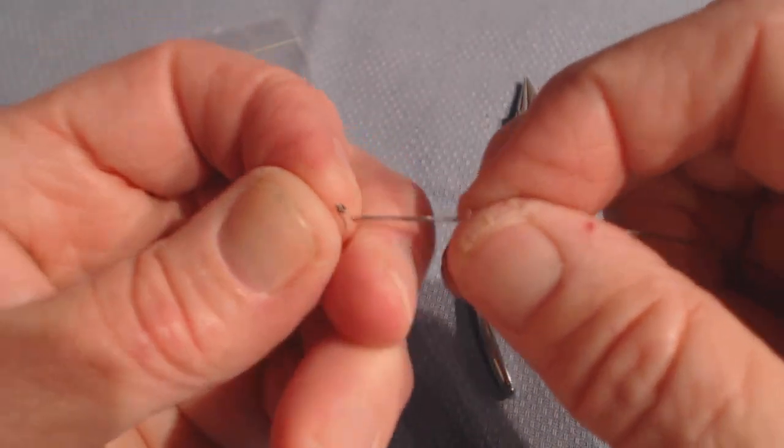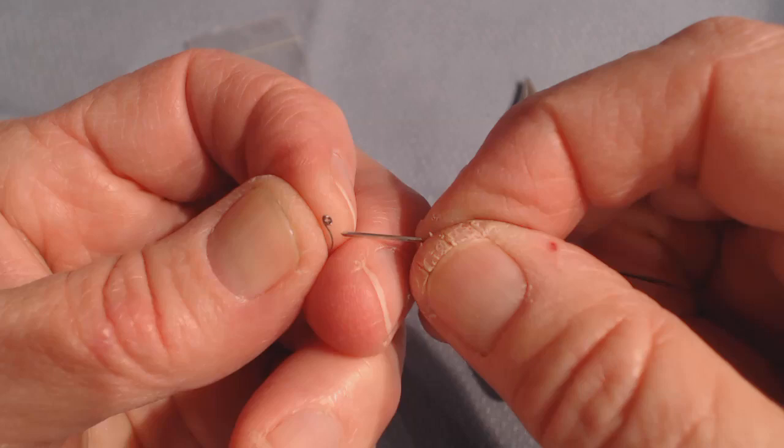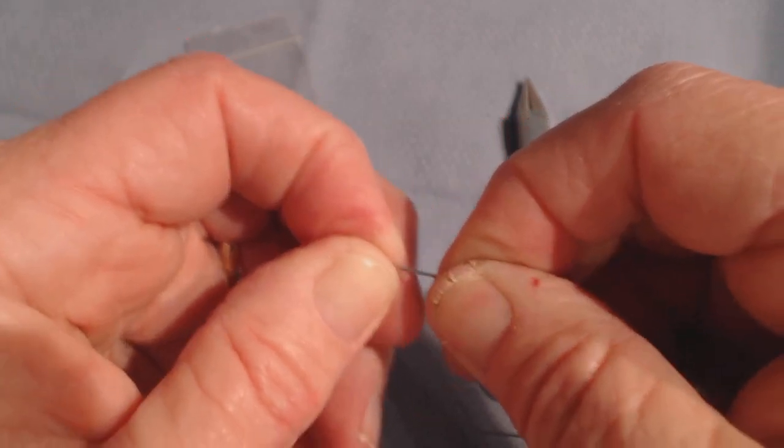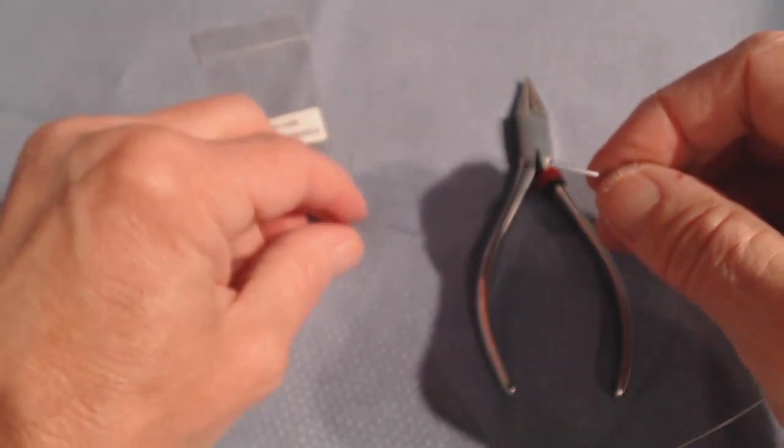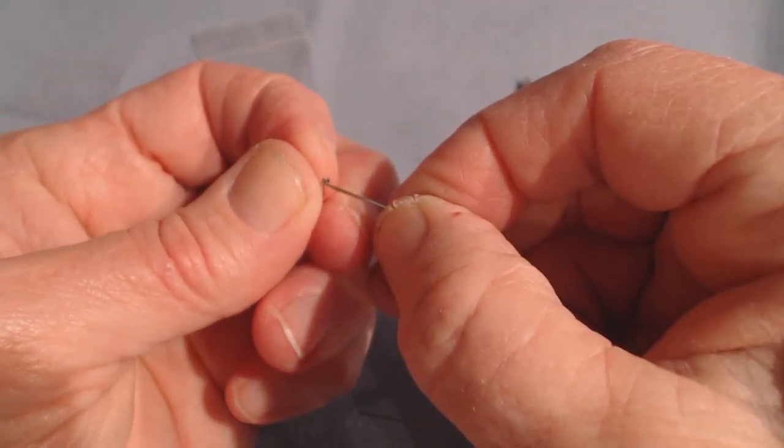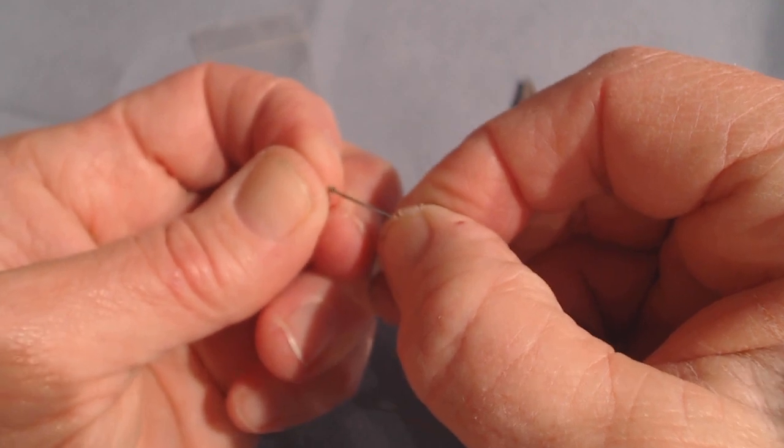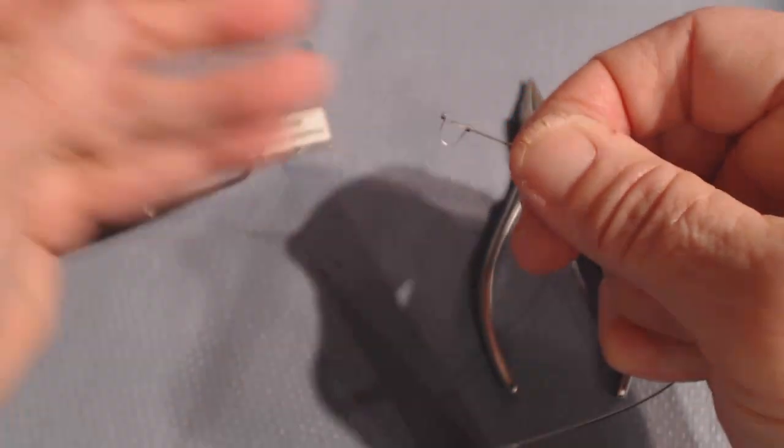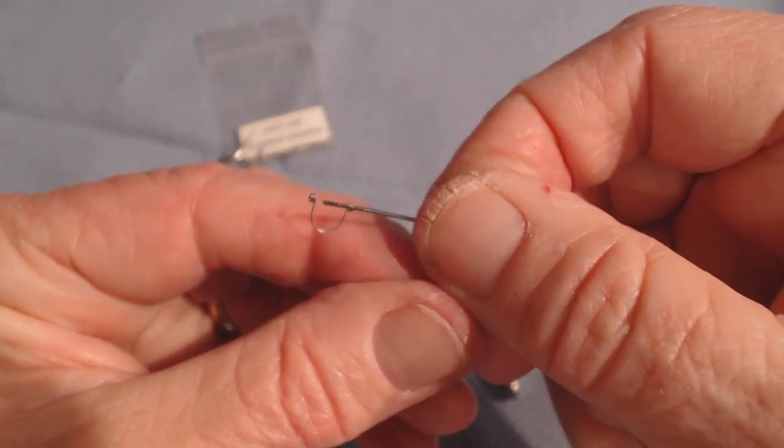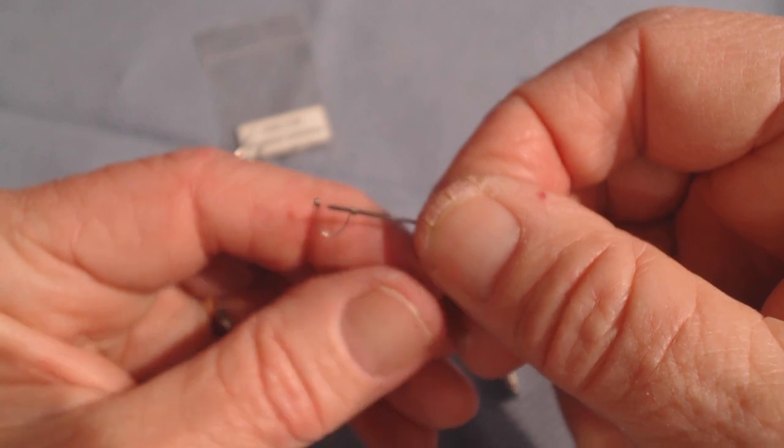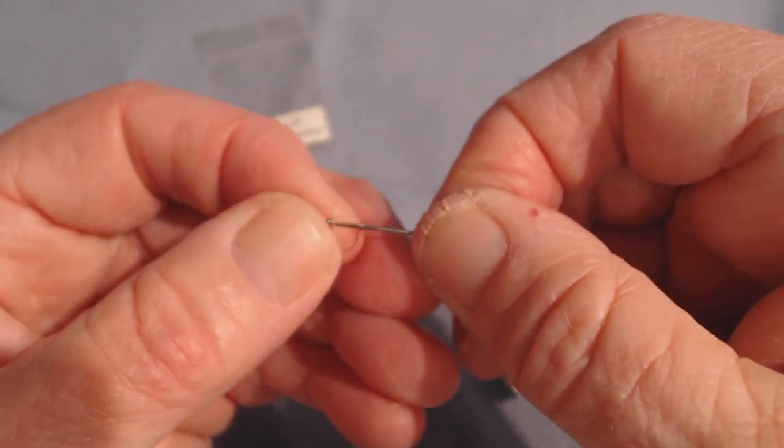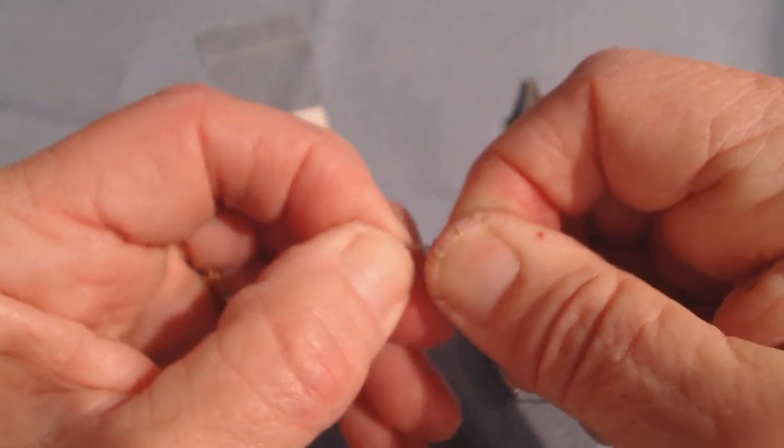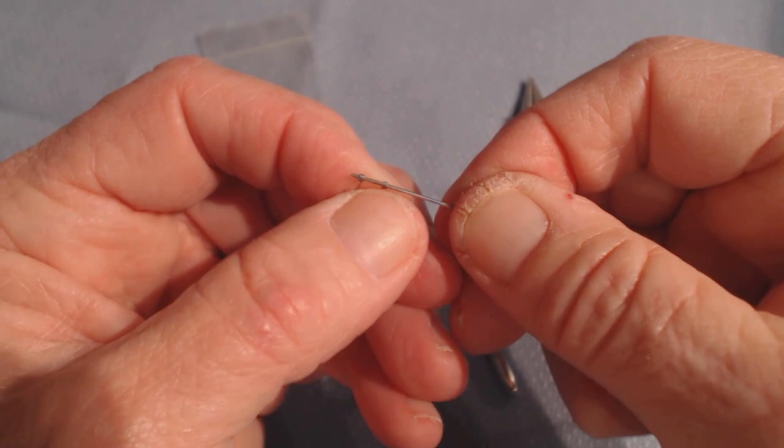This is going to be more difficult than you would expect to get this Warrant Spring on that arch wire, and so you have to put the wire in the hole. As I said, it's kind of tricky when it's got a little burr on the end of it. So you can see here, I've got that inserted partially on there. Now we're going to engage the other side. And now I have both sides on.